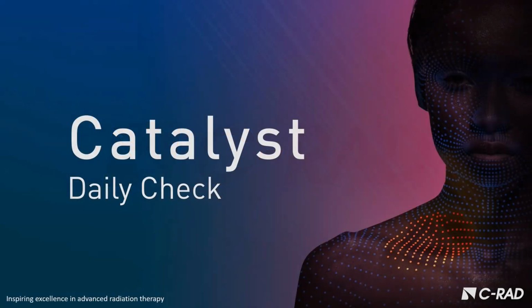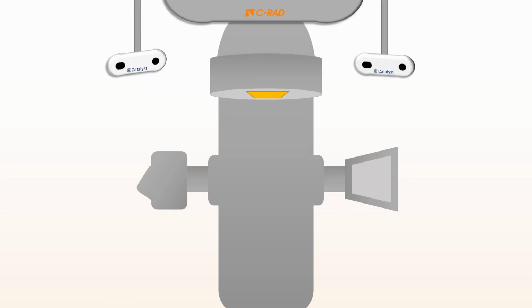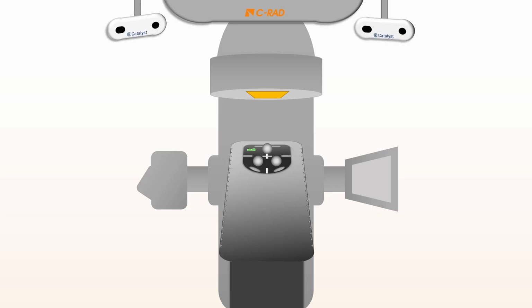Hello and welcome to this video about the daily check for Catalyst systems. For the demo in this video, we chose a Catalyst Plus HD system, but the daily check procedure is the same for all the classic Catalyst HD systems. For Catalyst single camera solution, however, there is a slight difference in the behavior of the Isocenter adjustment, which I will explain later in this video.